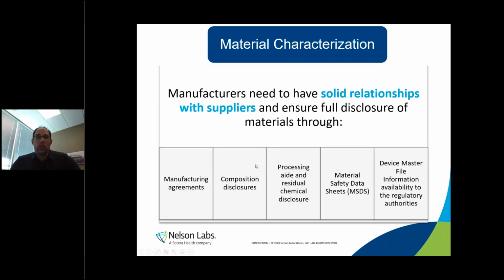Okay, so the other thing to look for, especially when you're changing materials, is the information you can get from your suppliers. This is essential. I talk to suppliers a lot, especially polymer suppliers, and I try to convince some of them of the amount of testing that they could put into a supply of a plastic to help sell their materials.